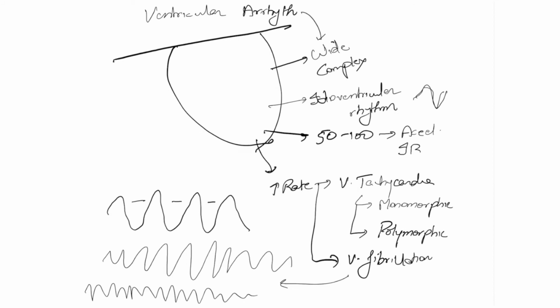A couple of things at this point. Using the term supraventricular tachycardia doesn't really convey a whole lot of information other than saying that the rhythm is originating above the level of the ventricles. So, when possible, you would want to be more descriptive of the diagnosis. So, for instance, you might want to commit to AVNRT or atrial flutter or whatever the case may be.